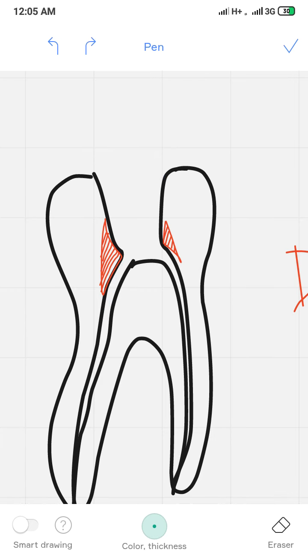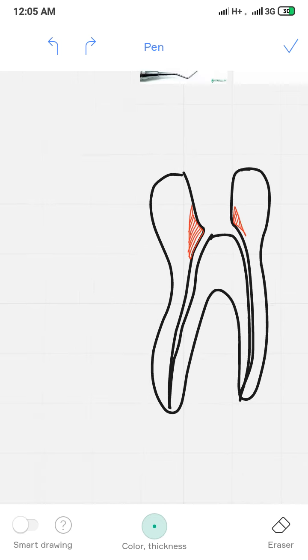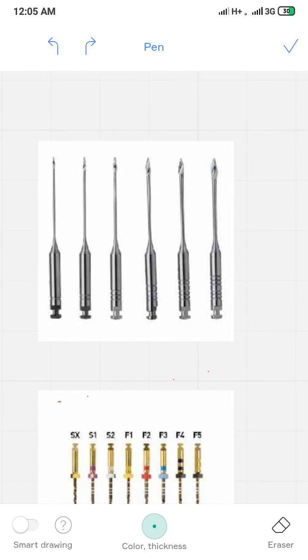Now, how to remove this dentinal triangle? In the past, dentists have been using Gates Glidden burs, and still do. They can be used in a slow speed micromotor or endomotor, I think, and they come in serial numbers 1, 2, 3, 4, 5, 6. You go on from smaller to larger, or you can go large to smaller. Both work fine.